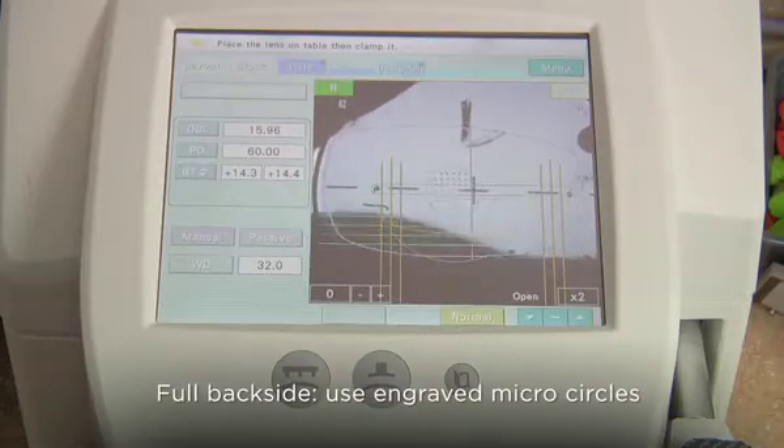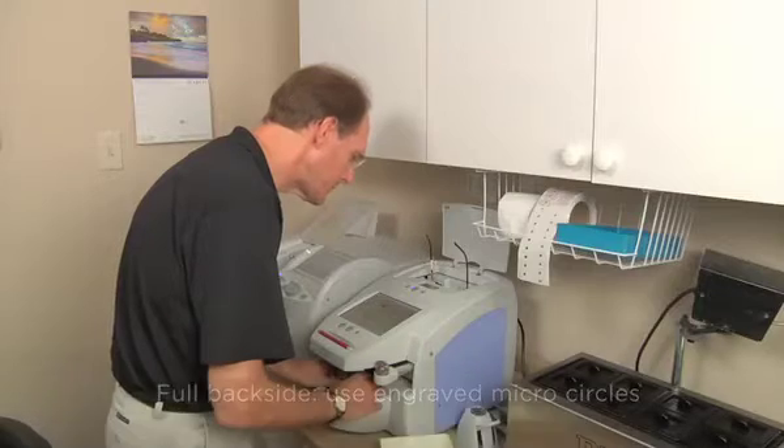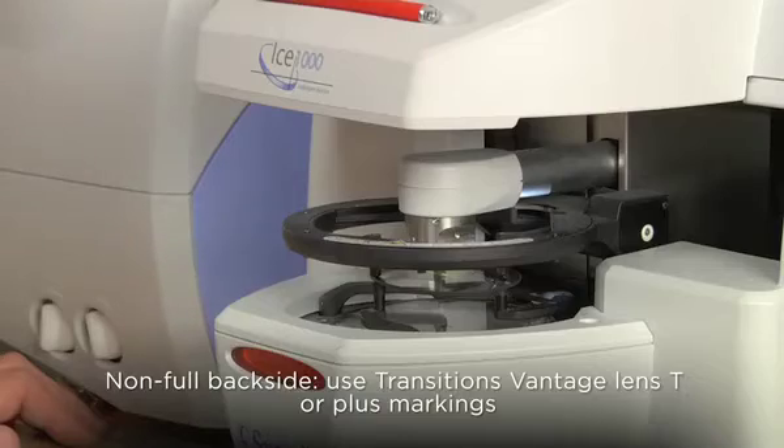For full backside products, use the engraved microcircles for alignment during finished blocking. For non-full backside products, use the remaining Transitions Vantage alignment markings.